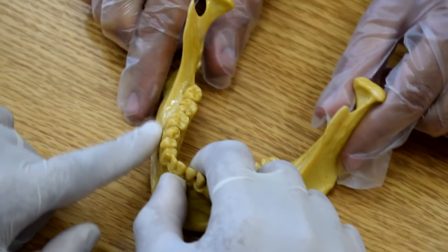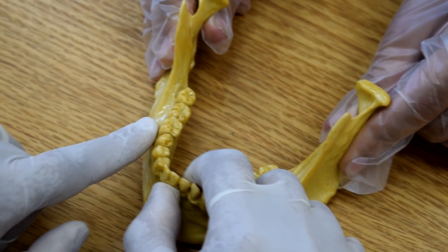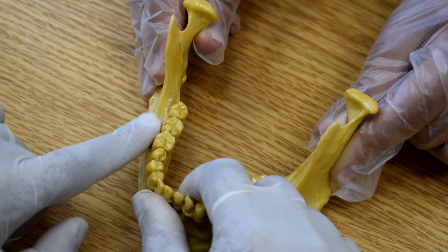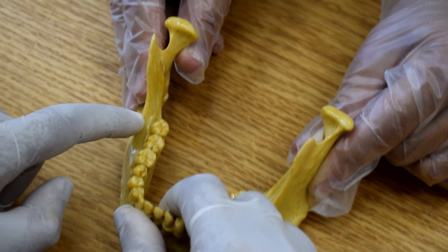Place your index finger of the non-dominant hand in the muco-buccal fold. Here — this is the mandible. We will try to show what you have to feel. While I will proceed, I will feel the external oblique ridge. This is the external oblique ridge.